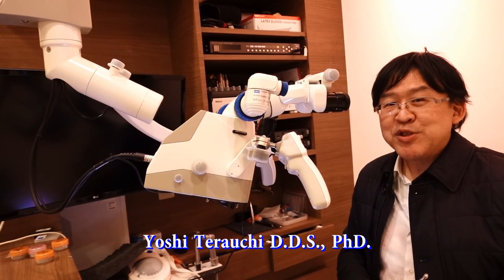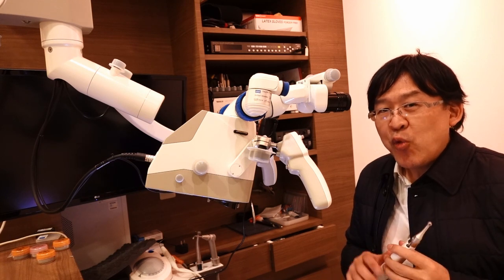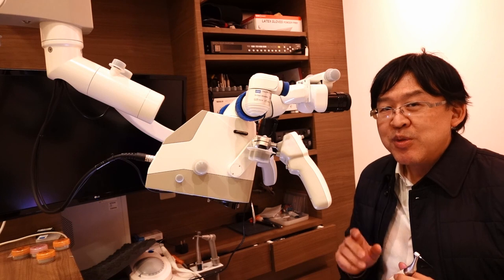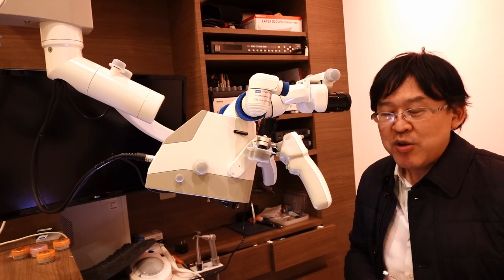Hello everybody, I'm Yoshi Terabuchi. I'm going to first break four instruments in a plastic block, then I will remove all of the four broken instruments. So here we go.